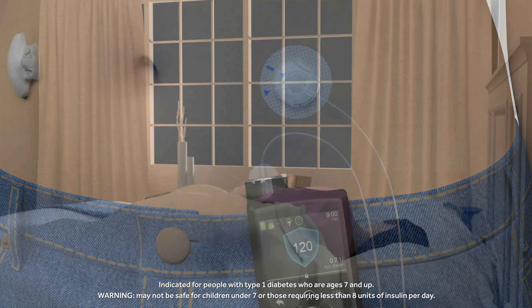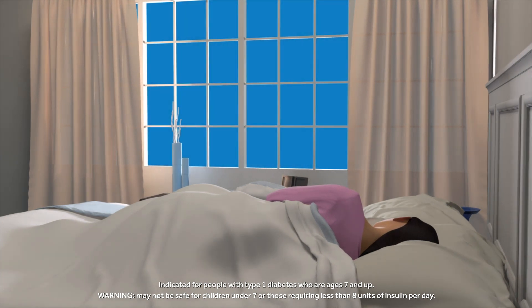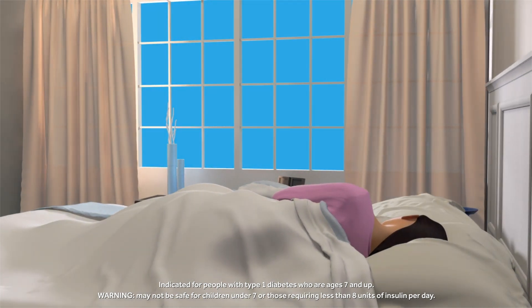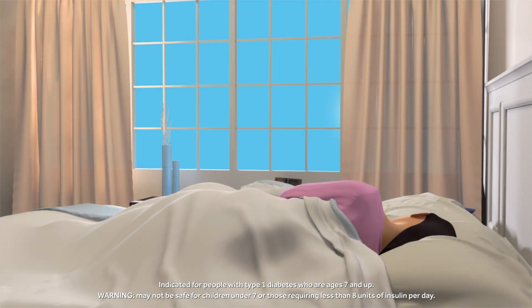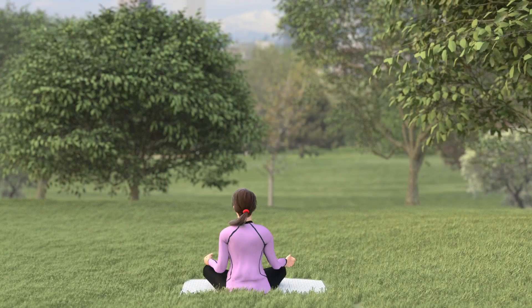The automation in the MiniMed 670G system enables people to spend less time managing their diabetes so they can enjoy greater freedom throughout the day and night. People can rest easier and trust that the system is working to help keep their sugar levels under control.